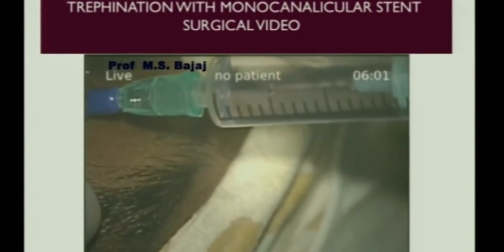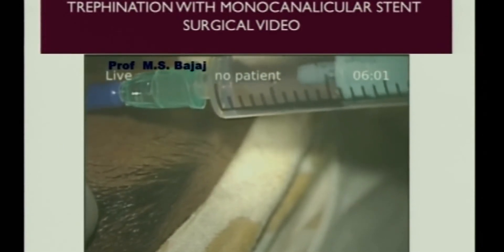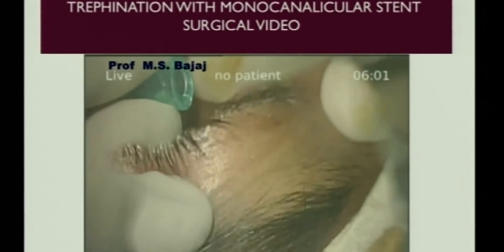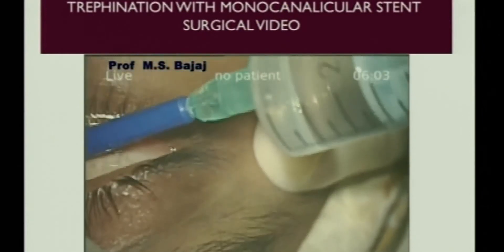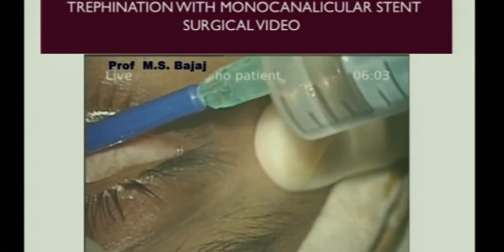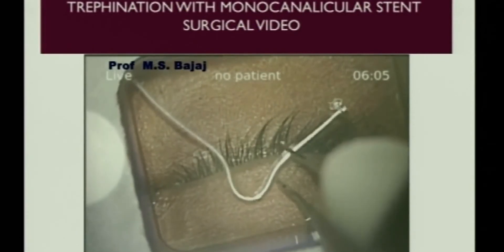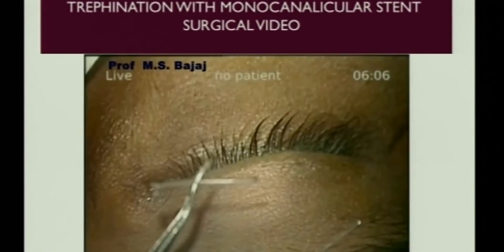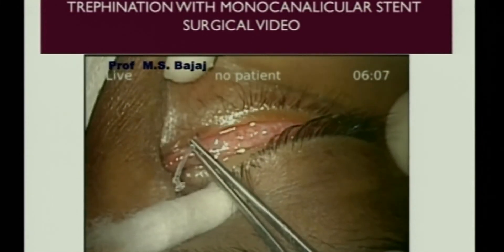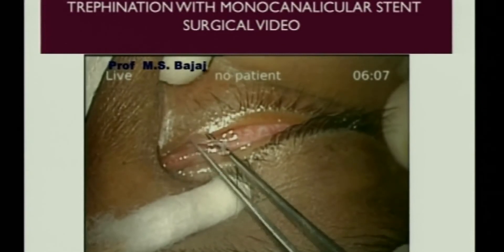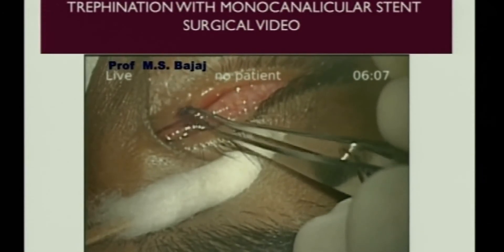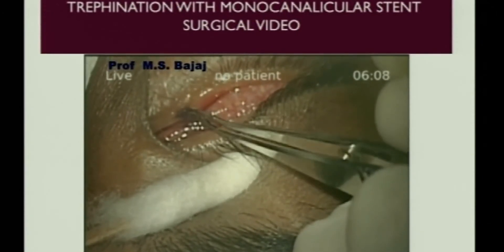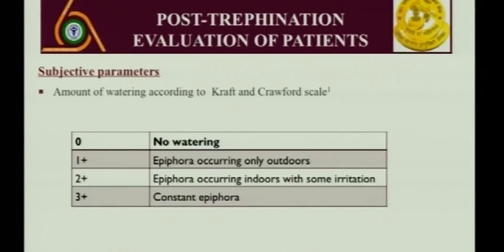In this series we also augmented the effect with Mitomycin C 0.04%, which was kept for about 30 seconds and then irrigated. After that, you can see the monocanalicular stent being inserted — it is snugly placed in the punctum without needing a suture.